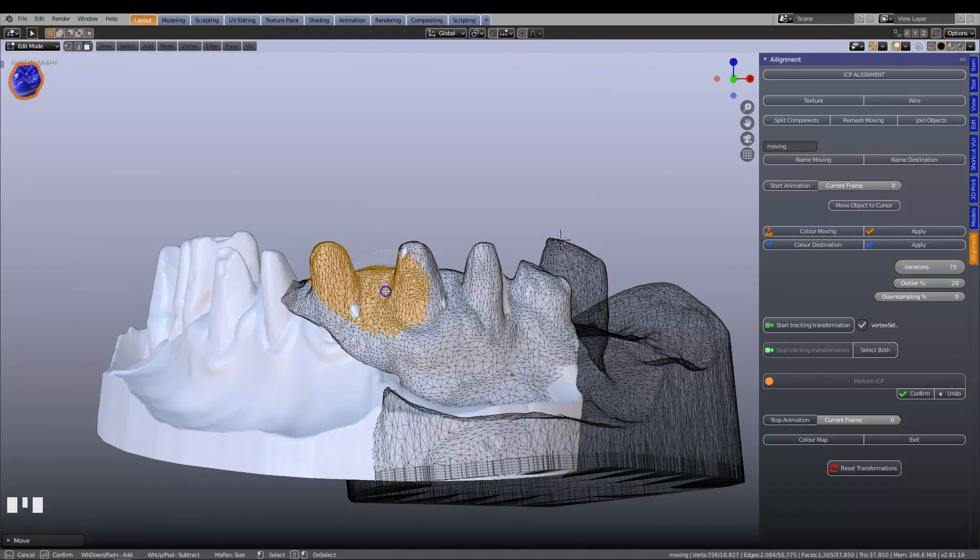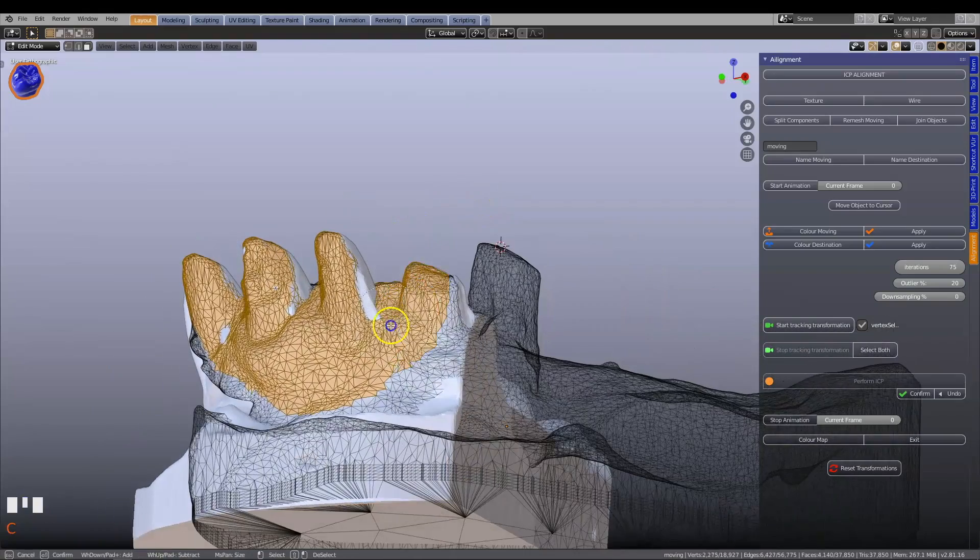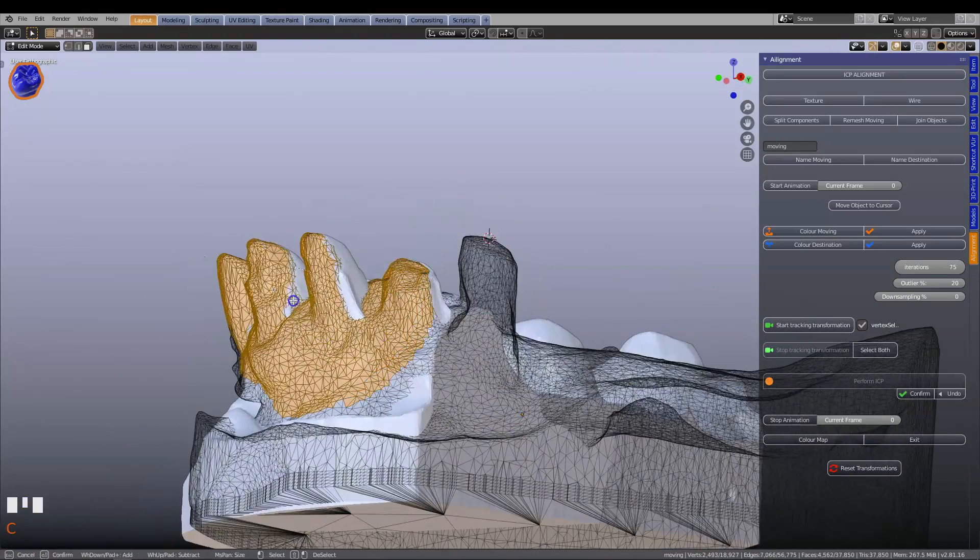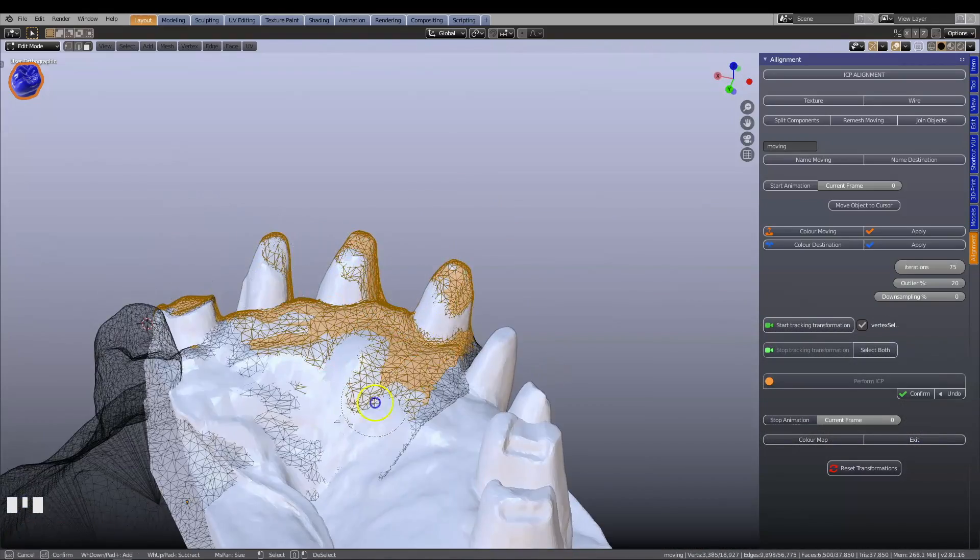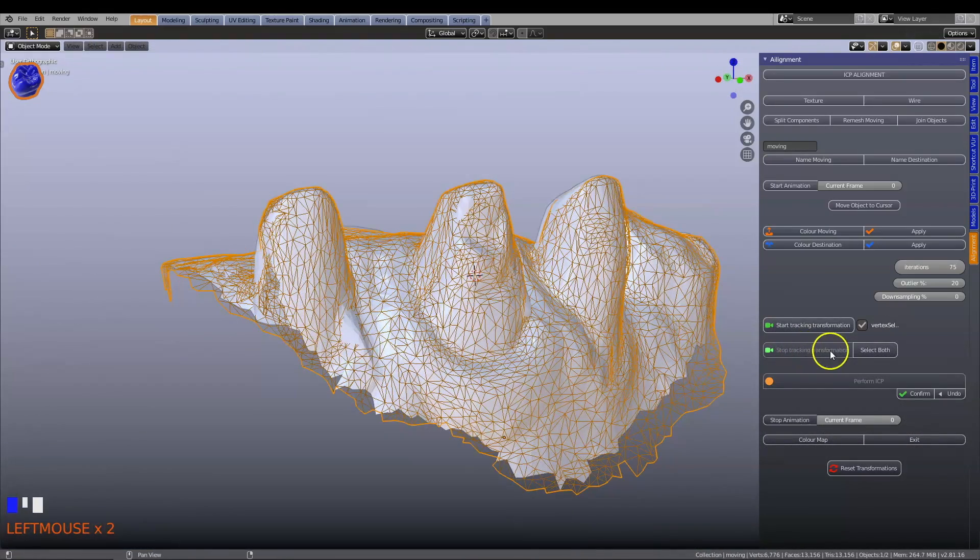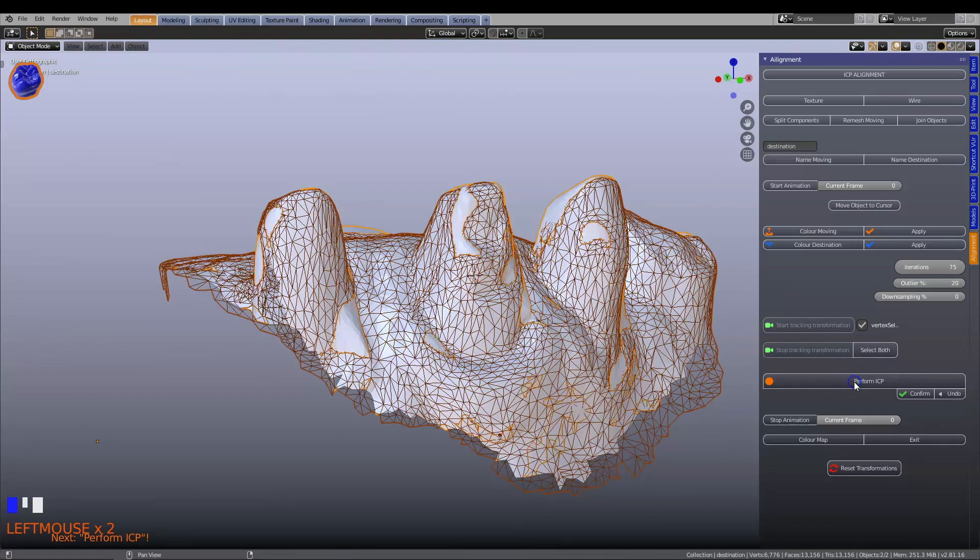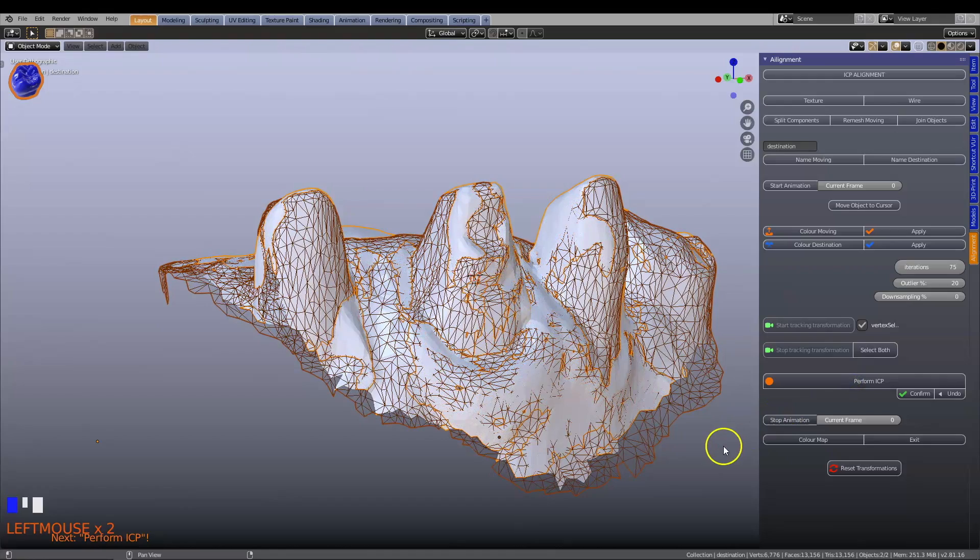Simply paint the areas you wish to align, and the ICP algorithms will do the work. Watch in real-time how the different objects overlay each other.